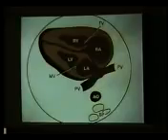This is the line which I was talking about, and it is visualized much better in this view. This is the tricuspid valve, and this is the mitral valve. If I draw a line, the septal insertion of this one is below the line and of this one is above the line, which is absolutely normal, a millimeter difference. If you concentrate on this, it is very easy to diagnose Ebstein anomaly, which we will discuss at the end.